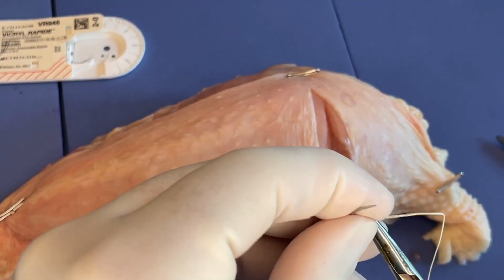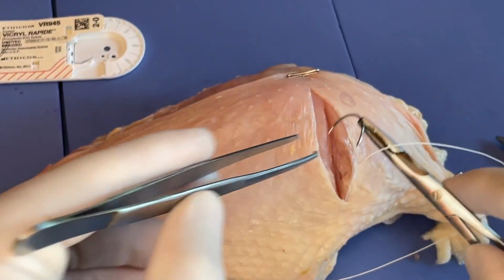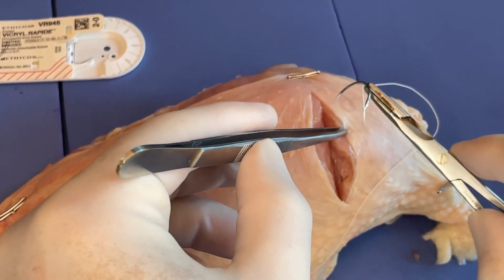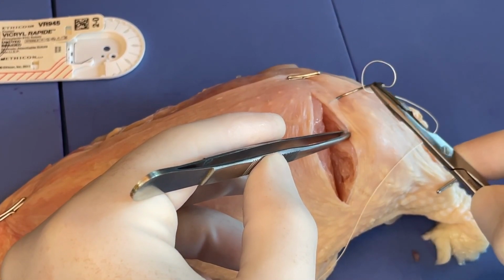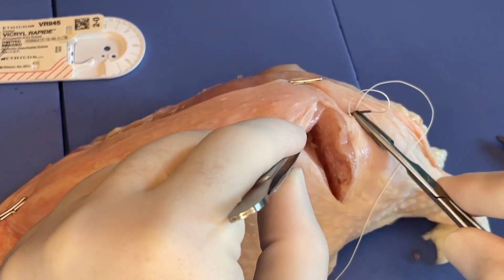So what we're going to do is just a simple interrupted suture here. We've got our cut chicken breast here with the skin on, so we're just going to stabilize the tissue here, and again we want to kind of poke through. We don't want to skim into the tissue here. If we're going a little bit deeper, we want to poke down at a right angle, come out.